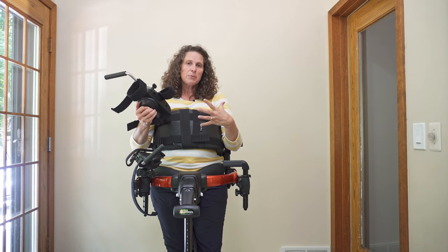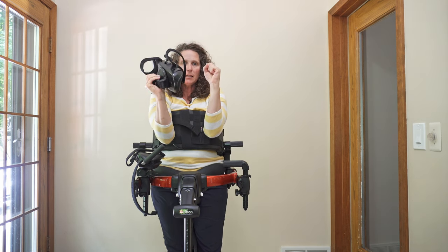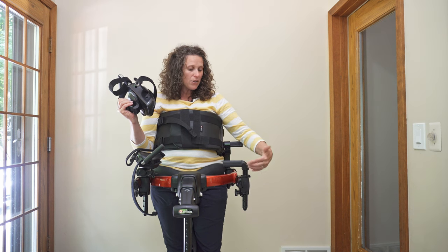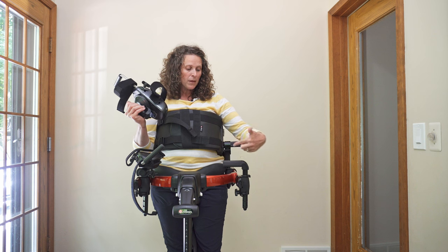Ideally you would want them here close to the inside, so if you can have them on the inside of the frame and it's comfortable for them, try that. But if not, you can have it on the outside of the frame with this L-bar tilting in.